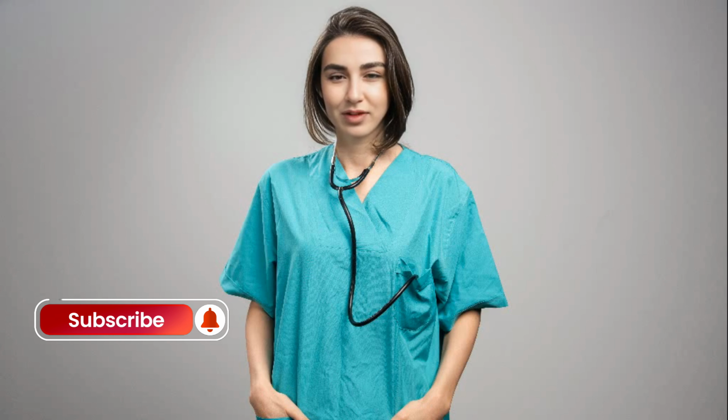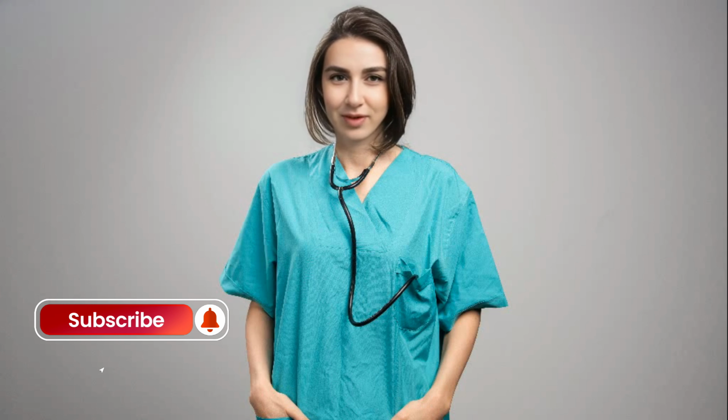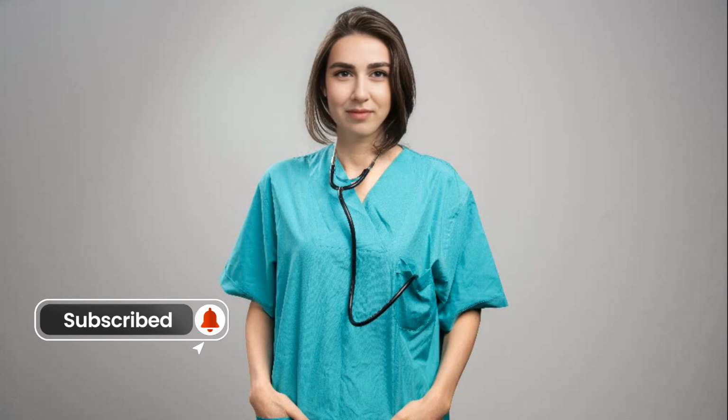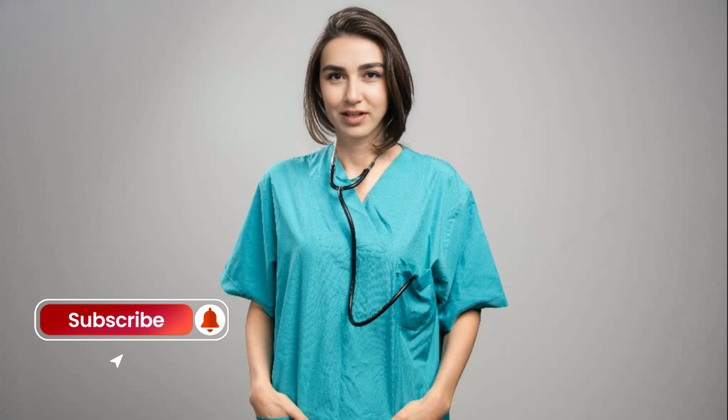2. Advanced catheter techniques. Cardiologists now use advanced devices and techniques, like stent-assisted techniques or rotational atherectomy, for calcified blockages, which help avoid complications. 3. Experienced medical teams. Angioplasty, performed by experienced cardiologists in well-equipped facilities, tends to have fewer complications. Overall, emergency surgery after angioplasty remains an uncommon event, especially with careful planning and modern techniques.